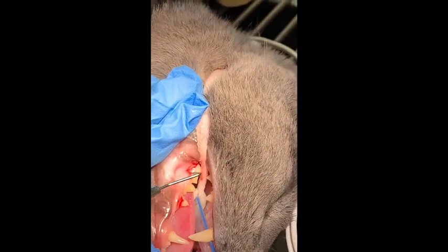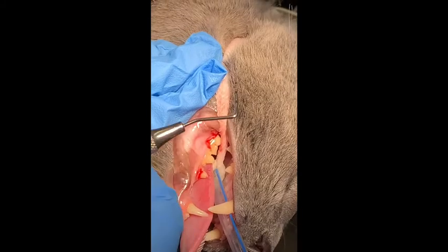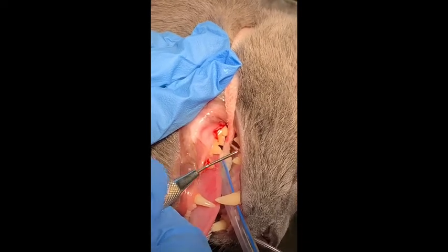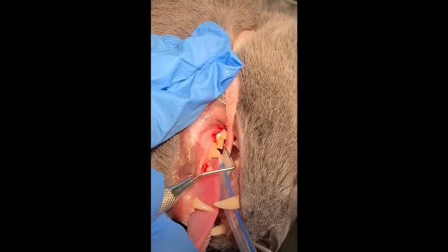And there you can see there's also recession around that tooth. The gum line's gone quite down a little bit. I'd probably say that's about 3 millimeters along there. And again, checking for mobility. So there's no mobility in that tooth. That looks quite good as far as that goes.